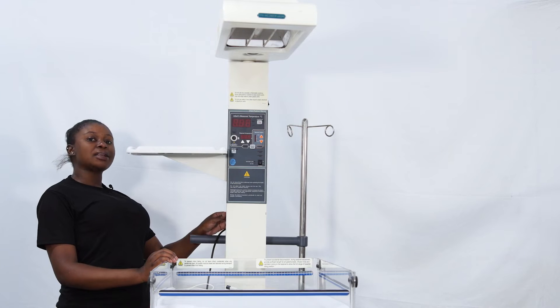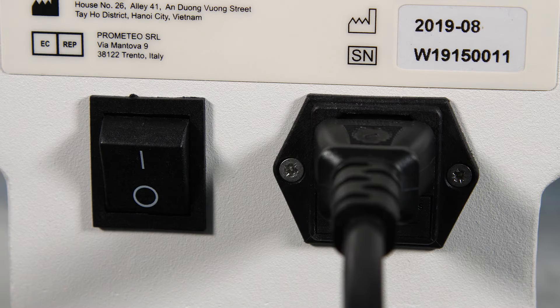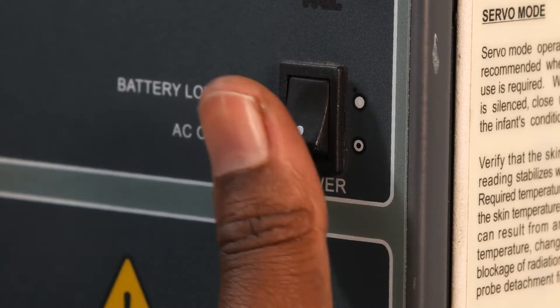Switch it on — there is a power button at the back of the machine. The Phoenix Radiant Warmer has the main power switch at the back, but there is a second switch on the front to turn on the control panel, so you have to switch it on again.